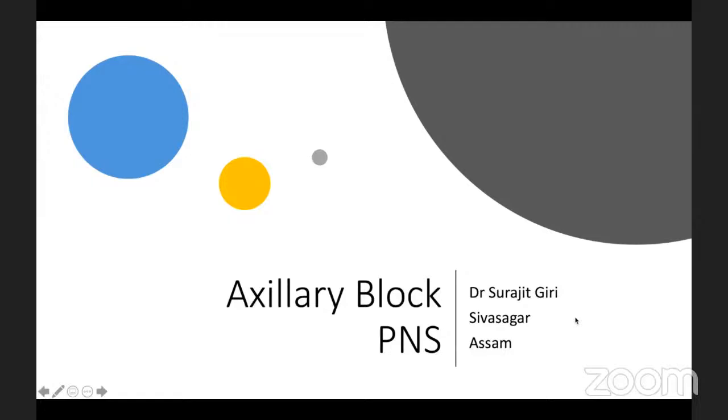And then what about the osteotome and the myotome? Ask the patient to push. See, I'm asking the patient to push. He cannot do it, means radial is gone. So I've asked the patient to pull the hand, but he cannot do it, means the musculocutaneous is also blocked. Then he is not getting anything, means 4 P's are gone. 4 P's gone means your radial nerve is gone, your cutaneous nerve is gone, no nerve is left, ladies and gentlemen. And now we can proceed for the surgery.